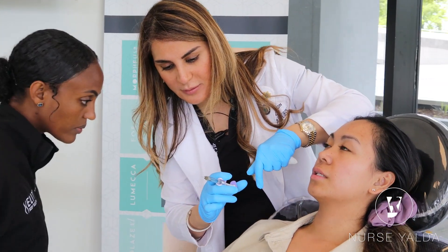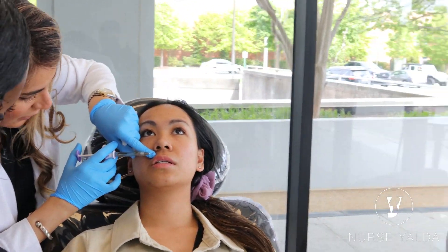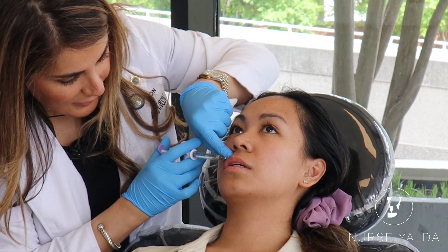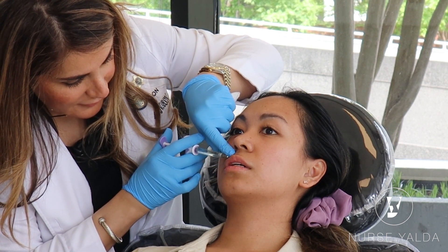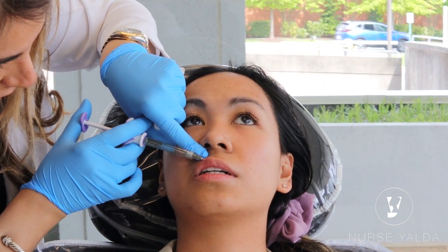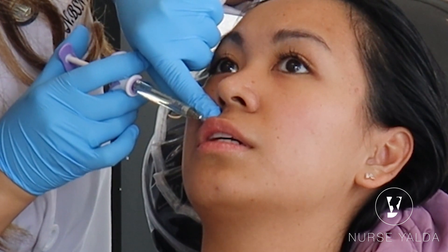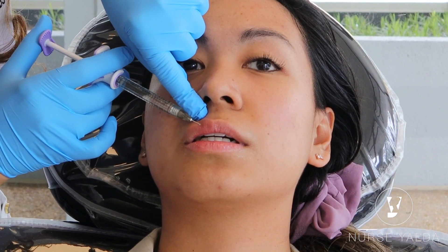To prime it a little bit, open up. From here — not too high, not too low, very close to the lip line — go down. This is just to contour the V-shape. I'm going to have you help with the other side. We start from the same entry point, and I'm going to change my angle.